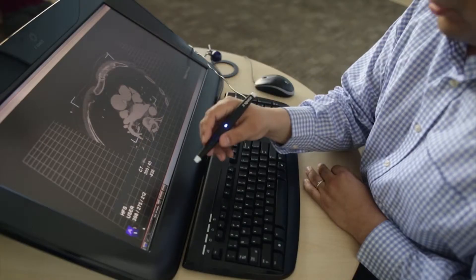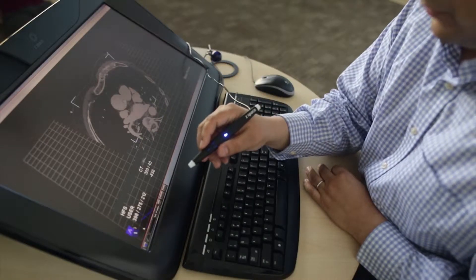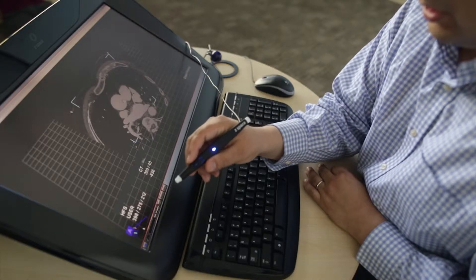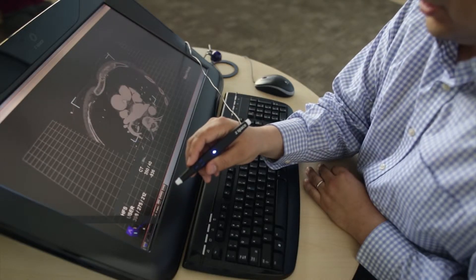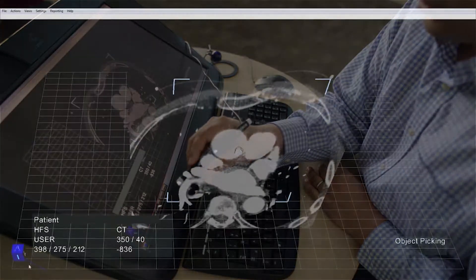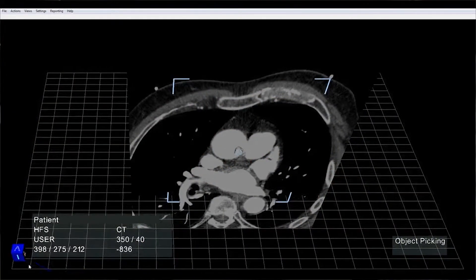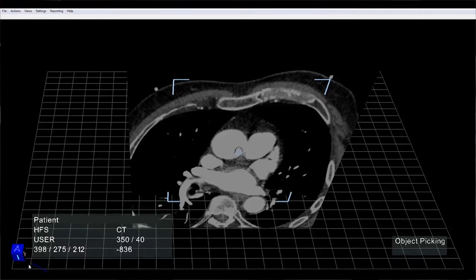At the lower left corner of the screen, you'll see an orientation box, and it's going to give you the anatomical orientation of the data that you're looking at.